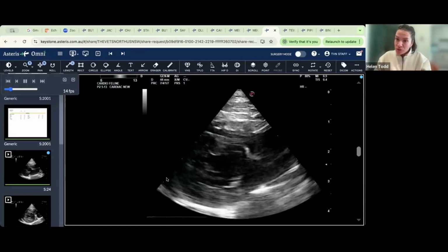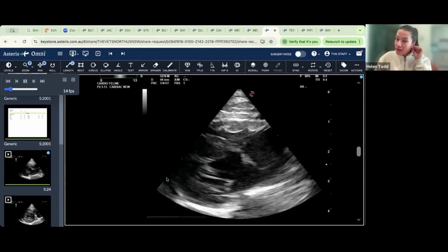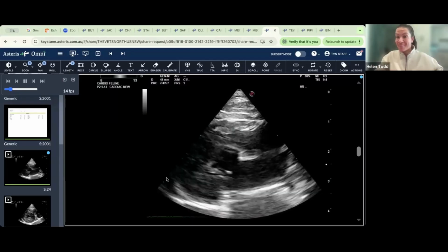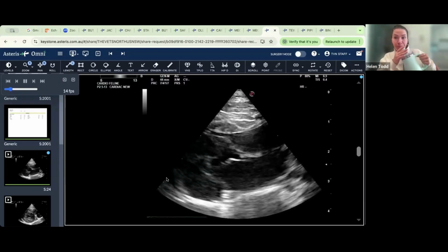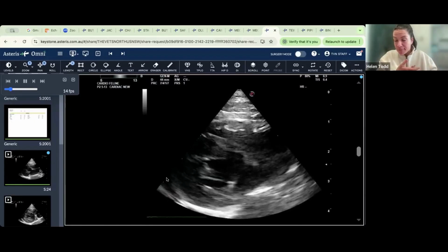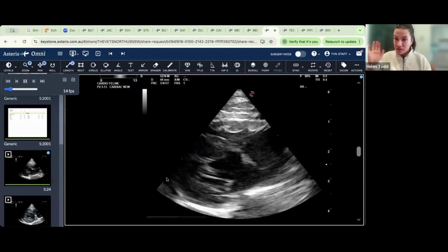If this cat came in respiratory distress, is this likely to be in congestive heart failure or not? You don't have to be definitive, but yeah, Julian's shaking his head for anyone that's just listening. I agree. So this is a cat with preclinical HCM. It's got a raging heart murmur. It's got raging HCM. Nothing to do with its respiratory distress whatsoever.